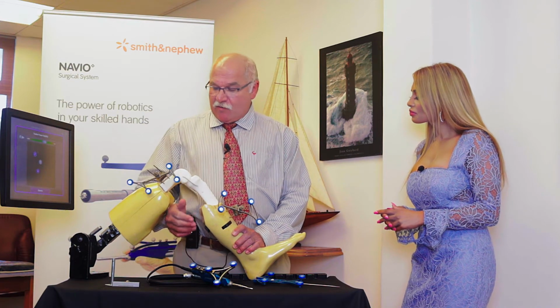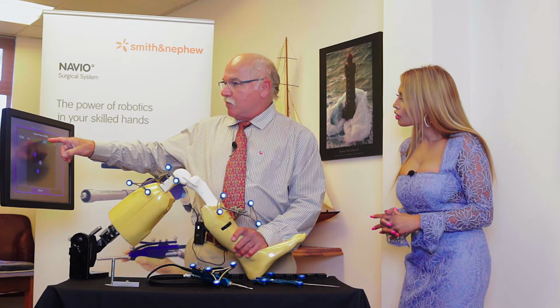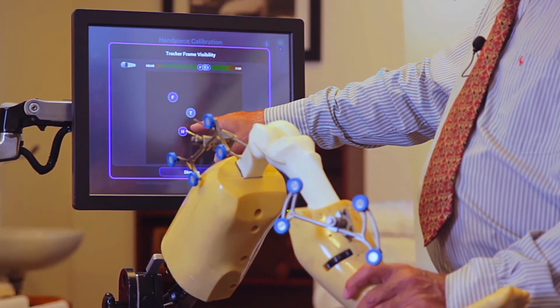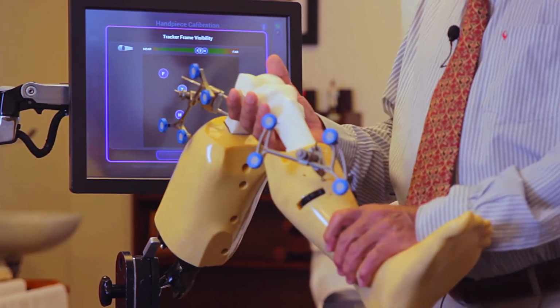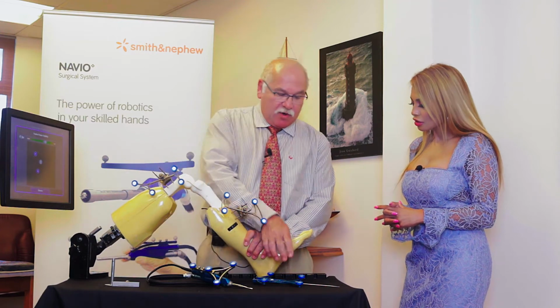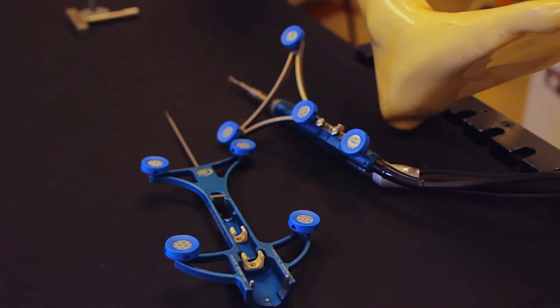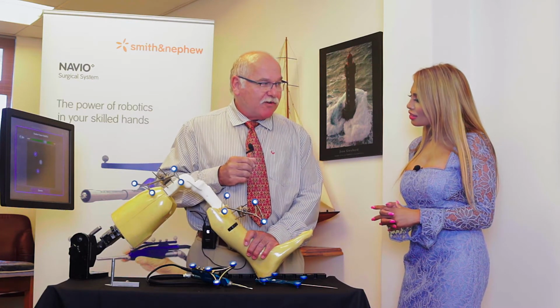So then we start off. We can see the arrays where they are visible, on the femur, the tibia, and the handheld instrument. Then we can take the leg through a range of motion, and we can use a wand to paint the knee so that we have a 3D picture of it.